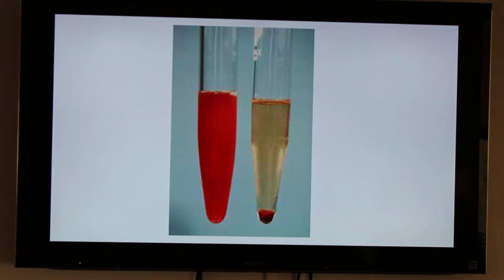This image, we want to go over our hematuria versus hemoglobinuria. So as we discussed in our questions, we want to centrifuge the sample to see which is which. So after centrifugation, we have the sample still red, so we know that this is hemoglobinuria. And here, all the red blood cells have settled, so we know that that's hematuria. So we did get some separation.